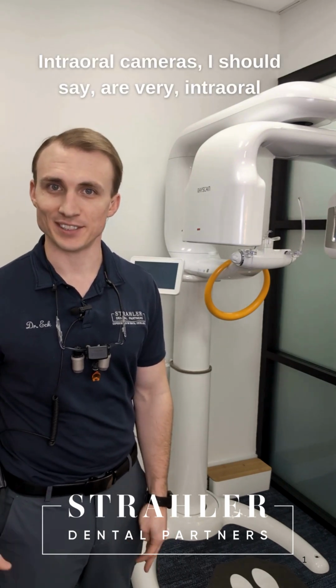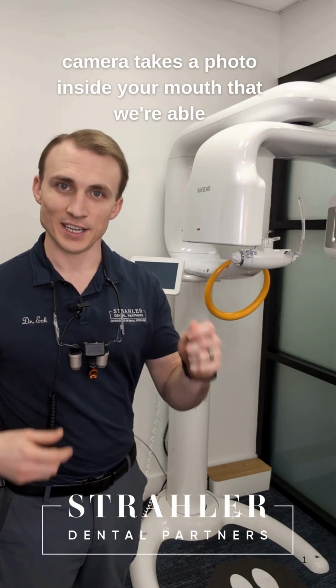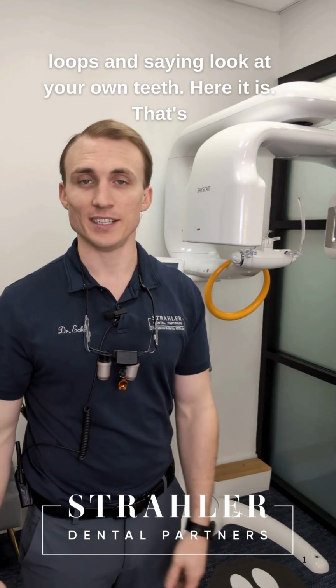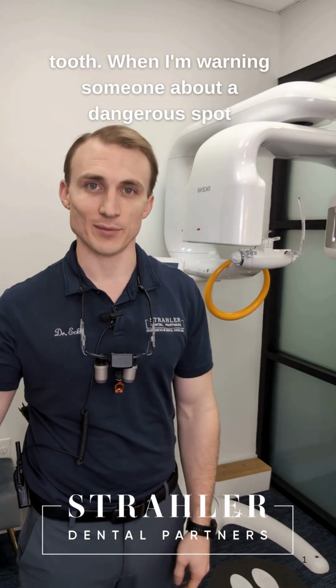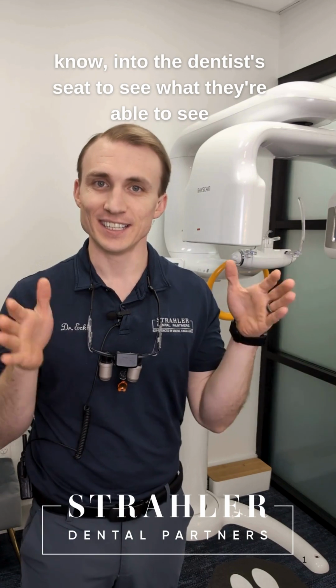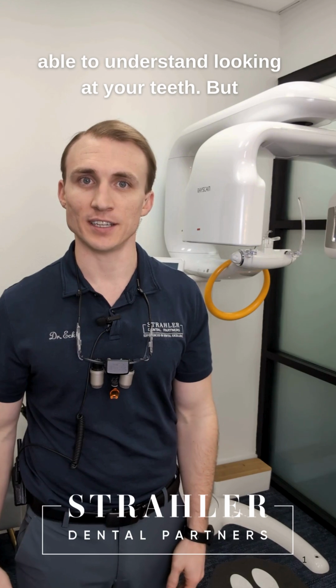Intraoral cameras, I should say, are a very important technology. An intraoral camera takes a photo inside your mouth that we're able to immediately put up on those big screens we have in the office TVs. And it's like giving the patient a pair of loupes and saying, look at your own teeth. Here it is. You're able to see what's happening with your own tooth. When I'm warning someone about a dangerous spot that needs to be cleaned, they're able to see it for themselves. And it's really nice to put them back into the dentist seat to see what they're able to see and understand what the dentist is able to understand looking at your teeth.